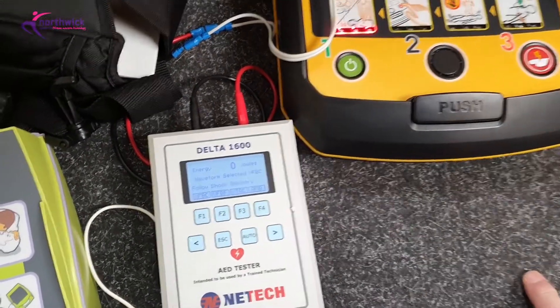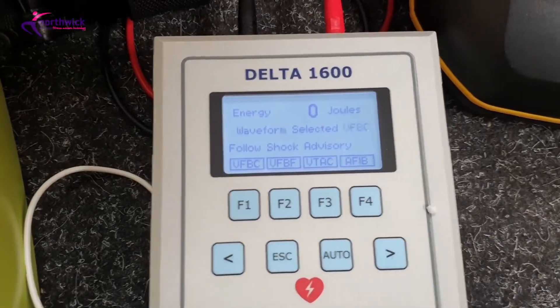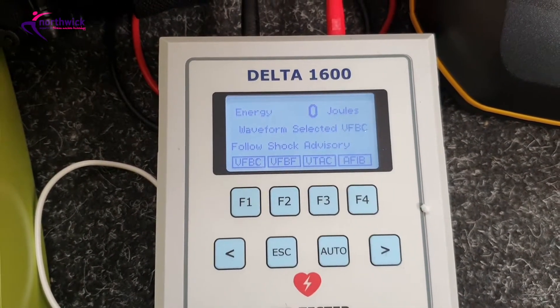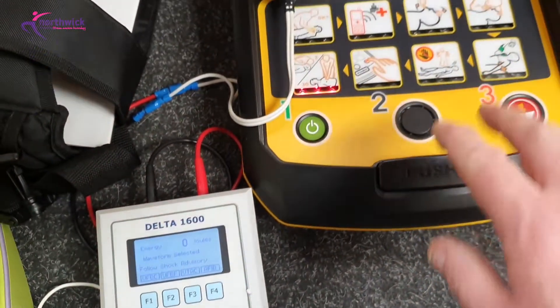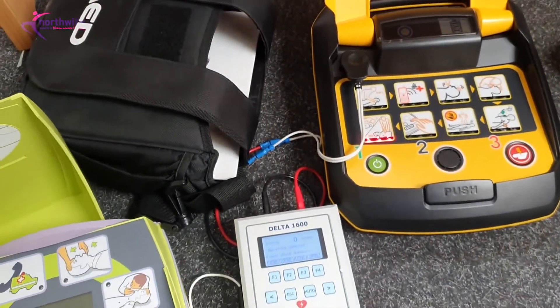Shock delivered — it is safe to touch the patient. So you can see the problem: the amount of joules delivered is zero. We don't see this very often, but it's a good indication of one of the problems with self-testing — your dependency on the unit's self-test is that it's not foolproof.